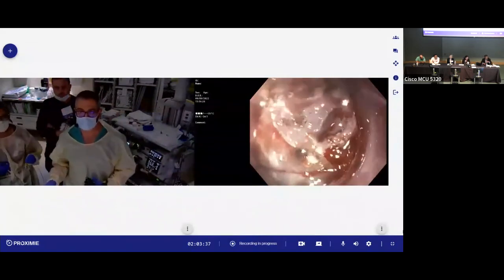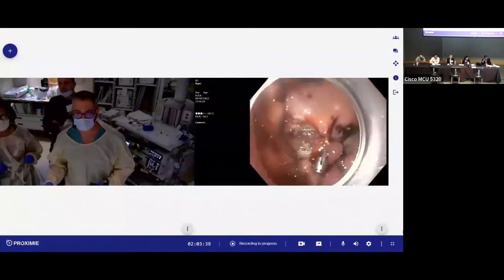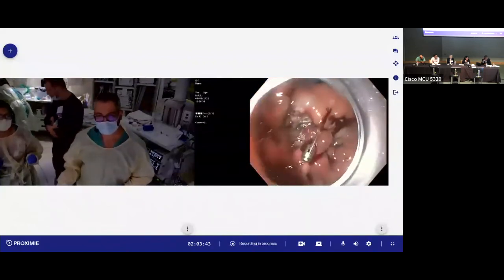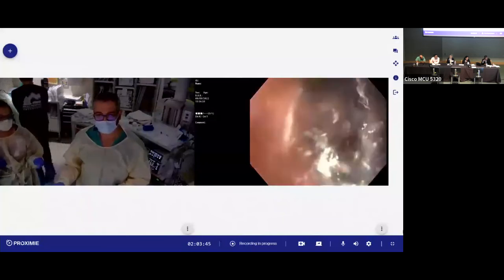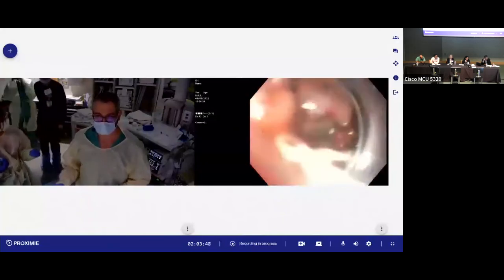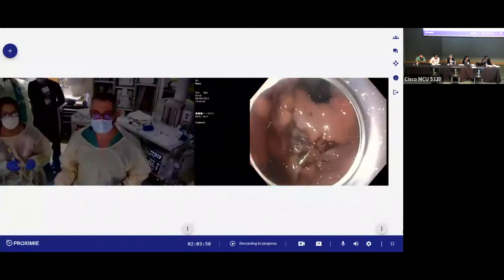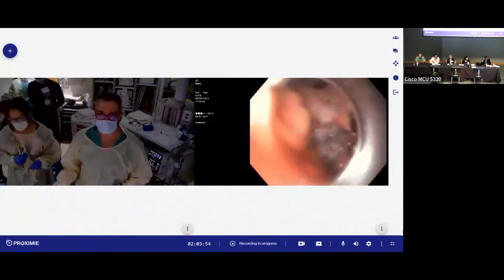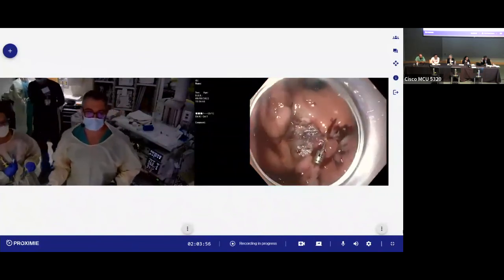Mohammed, I completely agree with closing the defect based on what you've seen. Can you just tell us what else you're doing for patient management? Are you inclined to giving IV antibiotics? Are you planning on keeping this patient overnight? What are you already thinking and telling your nurses?